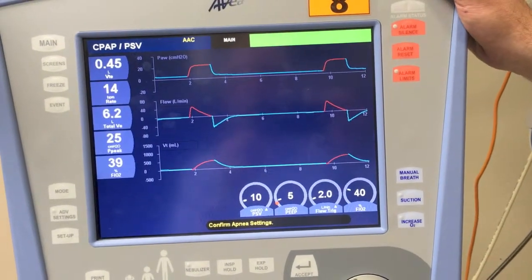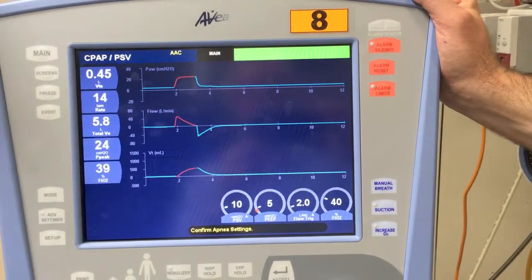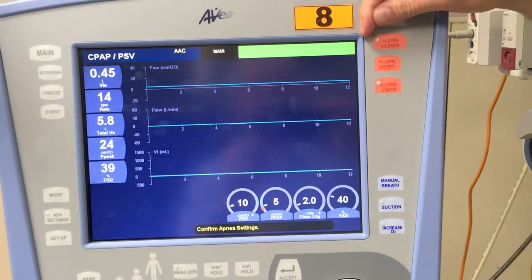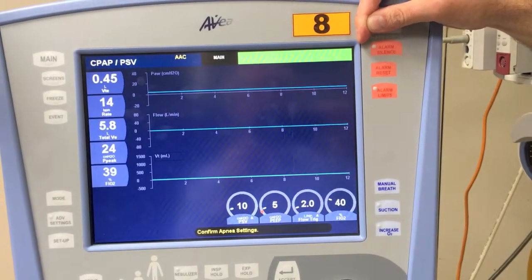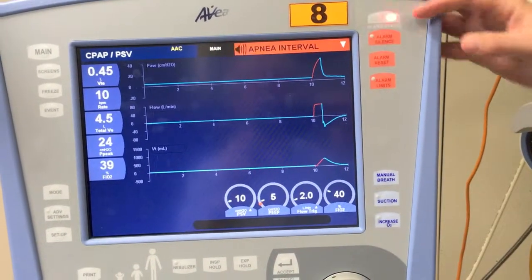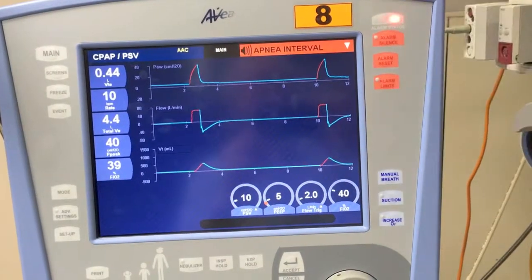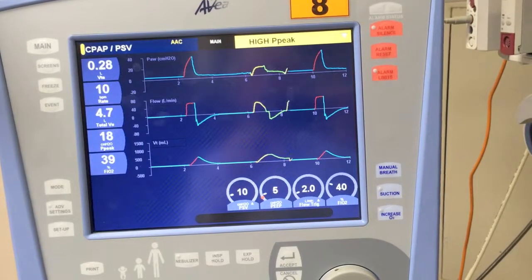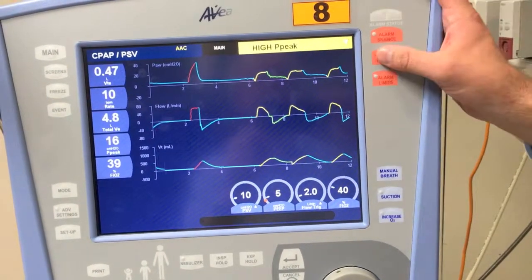Soon you'll see that it will alarm. At the moment it's green up the top, indicating that there's no alarm active. It will soon alarm in red, saying that there's a problem. And when the problem resolves, it will then change to yellow, which means the problem's resolved, and we can simply hit alarm reset.